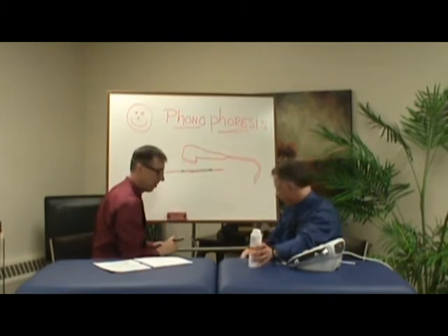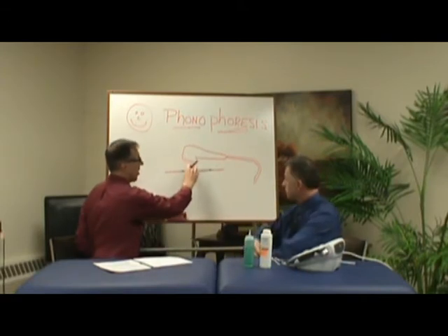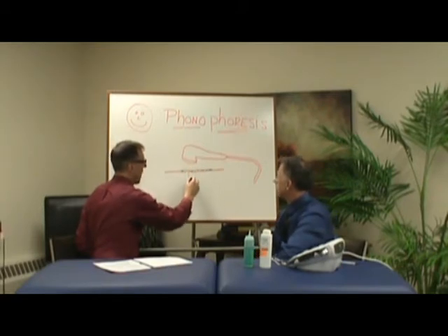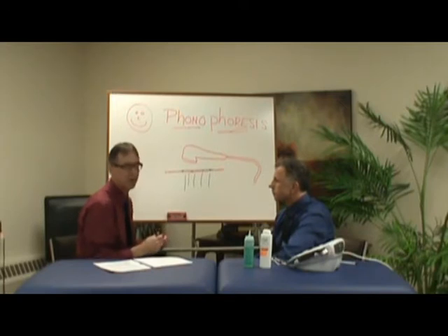Yeah, that's gel without the medicine in, and this is gel with the medicine in. So anyway, the head of the ultrasound rubs on the skin and it drives the medicine down into the surface, opens the capillaries so that they can take the medicine and bring it down. Now, I've read, and it's been a long time since I've read this, that it can go down as much as 5 centimeters.